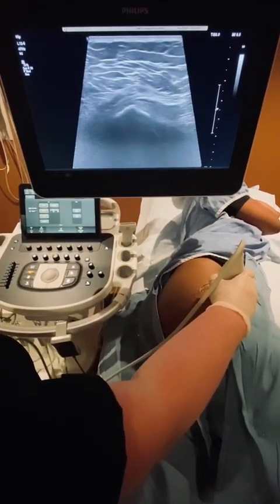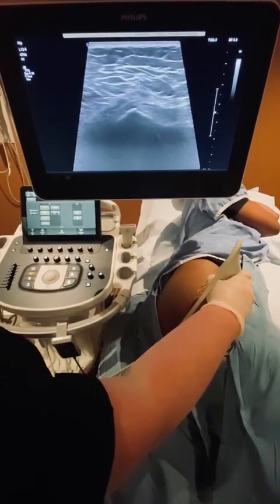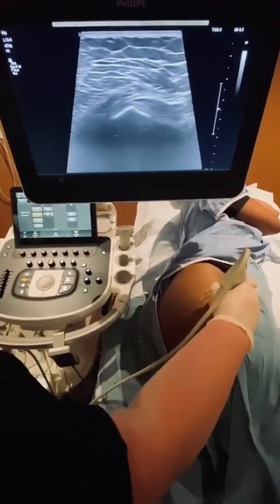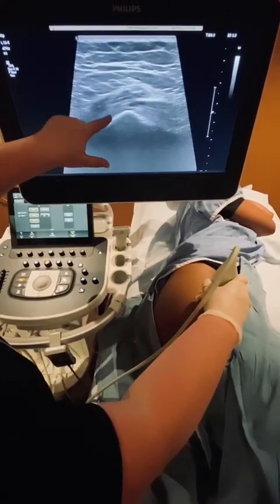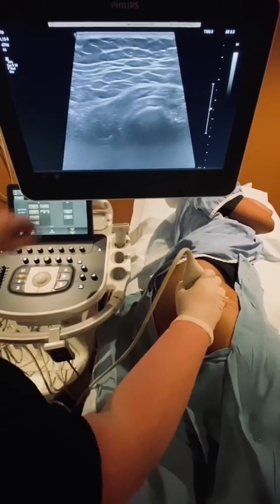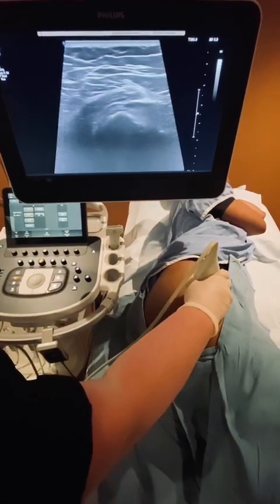That helps us orient to which side you'll find the gluteus minimus and which side you'll find the gluteus medius. The gluteus minimus tendon is the most anterior of the gluteus tendons, so it's going to be on the right side of the screen. Its bony attachment to the greater trochanter is the anterior facet. On the posterior side of the screen, you'll find the gluteus medius tendon, which inserts onto the lateral facet of the greater trochanter. If you sweep a little more posterior, this area is the greater trochanteric bursa along the posterior facet.